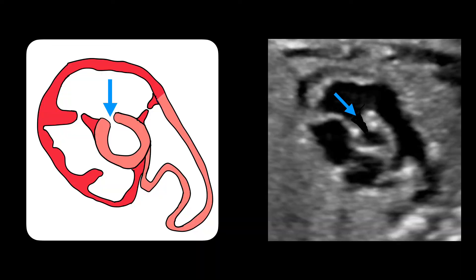This is the image of the RVOT view, or circle sausage view of the right ventricular outflow tract. You can see both the location of the tricuspid valve and the aortic valve. The blue arrow marked in both pictures represents the location of the membranous VSD. You can use this view as an additional view to confirm the membranous VSD, or if you have an echo dropout resembling a membranous VSD and have a doubt, use this image to reconfirm your finding.